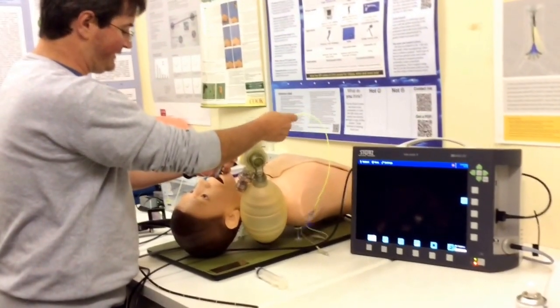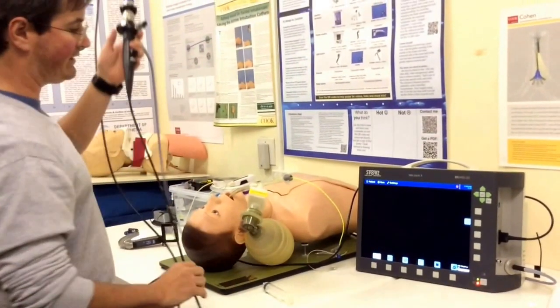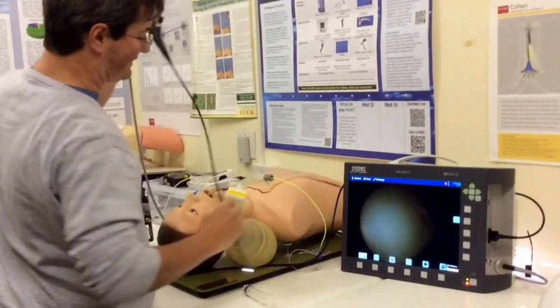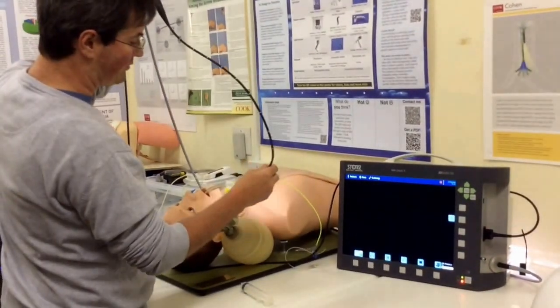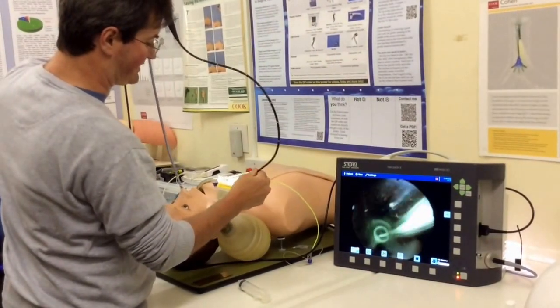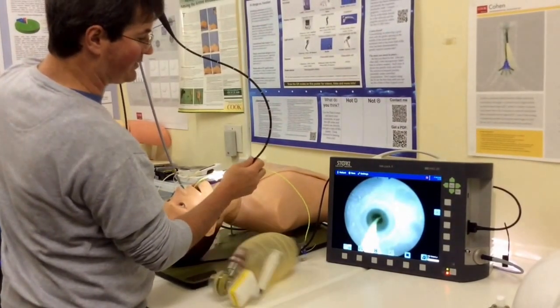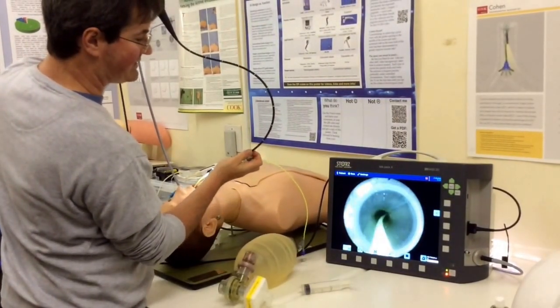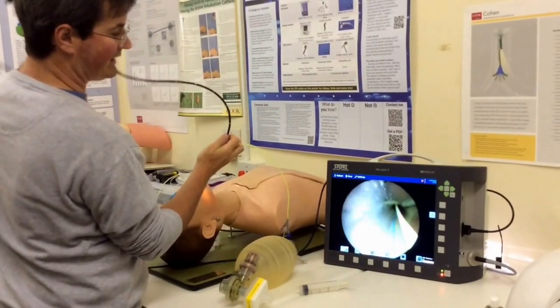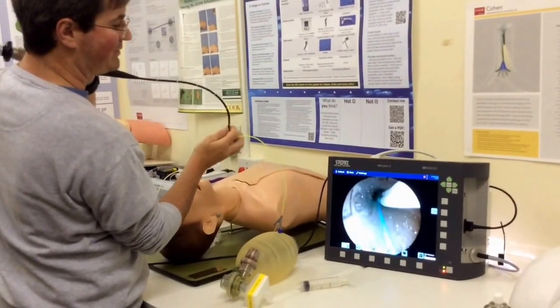Now I can go ahead and place my bronchial blocker. The first thing I do is feed the bronchial blocker down the ET tube before placing my fibroscope into the tube. I want to chase the bronchial blocker down the ET tube. Now we're going down the ET tube — you can see the bronchial blocker leading the way, and I've come up against the hub of the bifurcation.